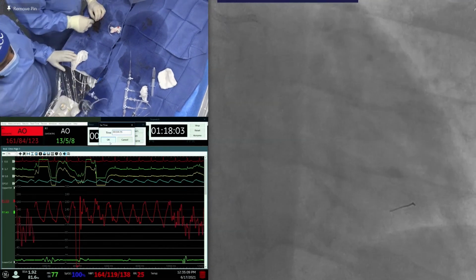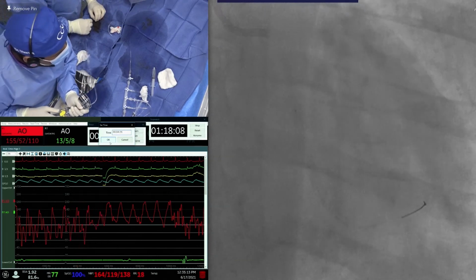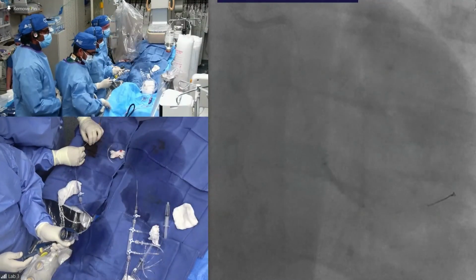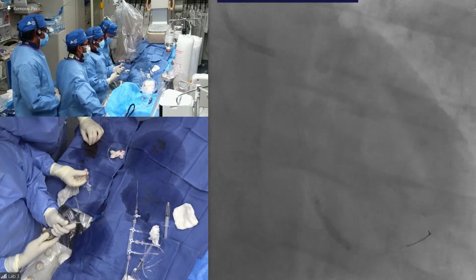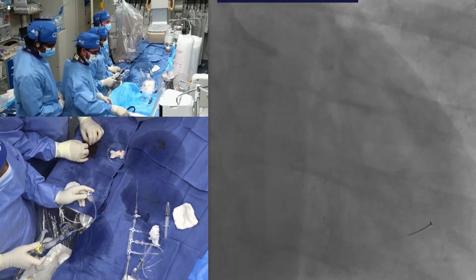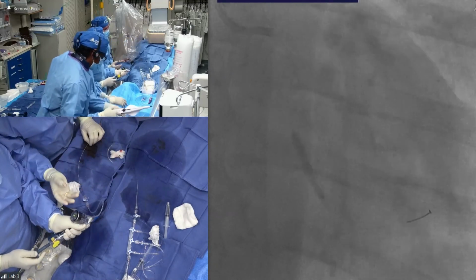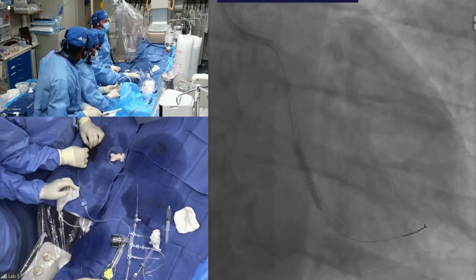The problem is we've done it for 30 years, and in two or three years you'll get late effects that you're not aware of. But at least in the first couple of years, it seems to work. So Dr. Colombo doesn't need it because he has drug-coated balloons. We don't have brachytherapy in Europe. It's not available. Dr. Nicholson? I would echo the sentiments that Dr. O'Neill said. Early on it looks good, but I worry about the late-term effects. All right.